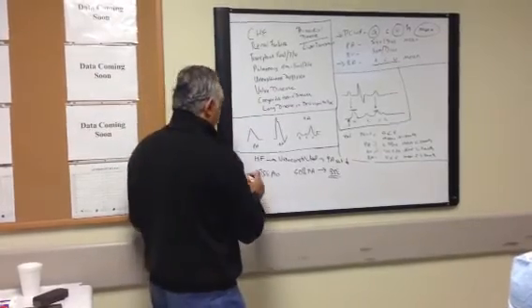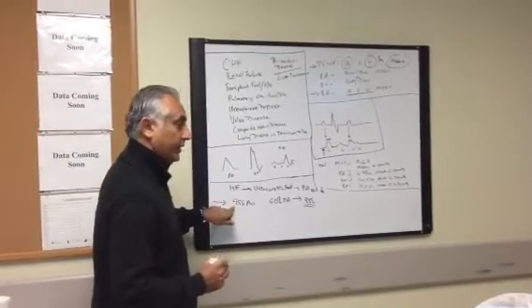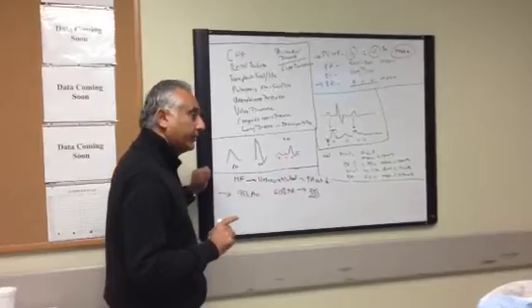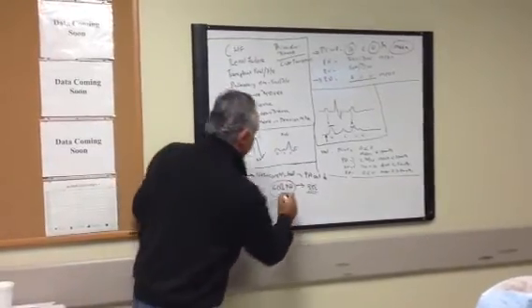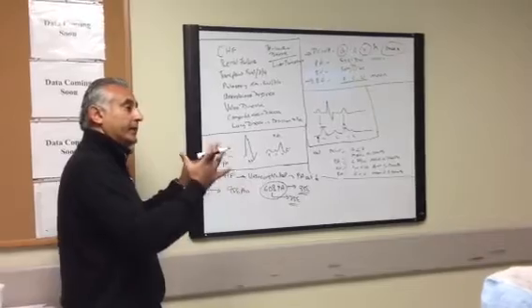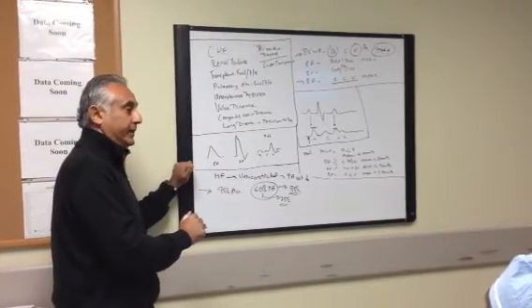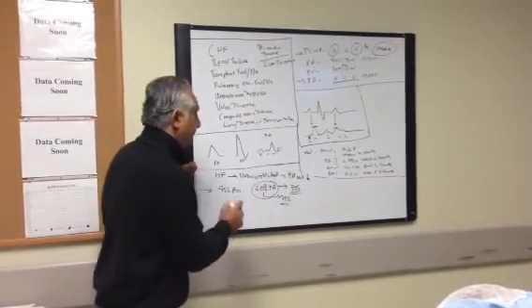All right? So now, the good news is that if I start to treat them for their heart failure, if I have a Swan in place, I don't need to measure cardiac outputs. I can just measure this number. If this number moves towards 75, I know I'm doing the right thing, because I'm normalizing that state. So I must be improving their hemodynamic status. So I don't need cardiac outputs. I don't need anything else. I can simply do this.